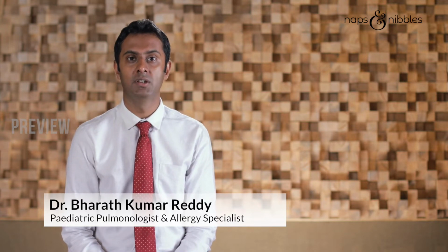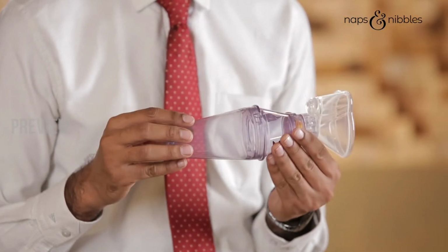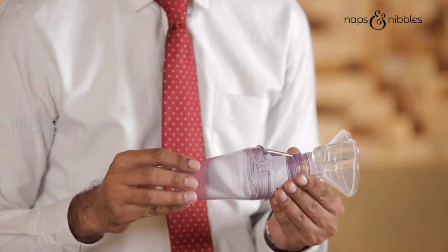Let us go through the steps to use the inhaler along with the spacer correctly. For children below 4 years of age, we need to use a spacer with a mask to make sure that the medication is delivered properly. For children above 4 years of age, we can use the spacer without a mask. So let us first go through the steps for children above 4 years of age.